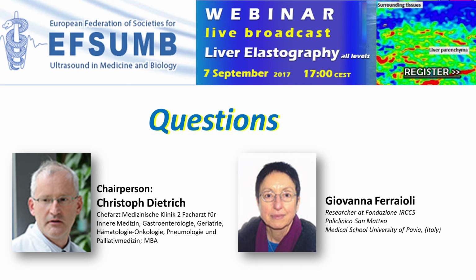Usually in clinical practice, the operator uses only one, and each company has its own reliability factor, quality factor that should be used. From my point of view, all the companies have developed a good quality factor that should be followed before taking into account also the recommendations of the guidelines. I hope I answered the question. Thank you so much.